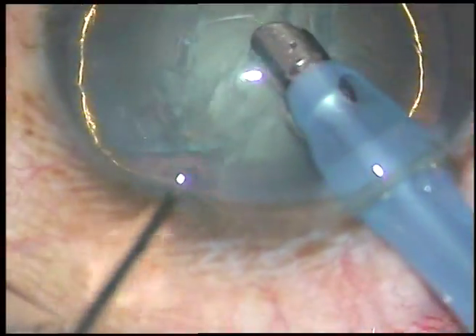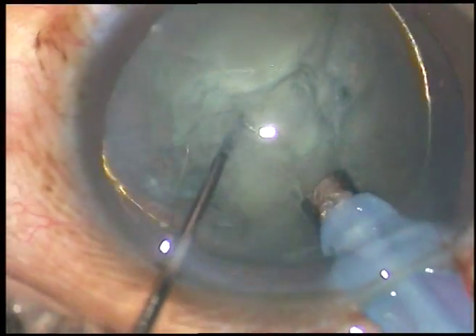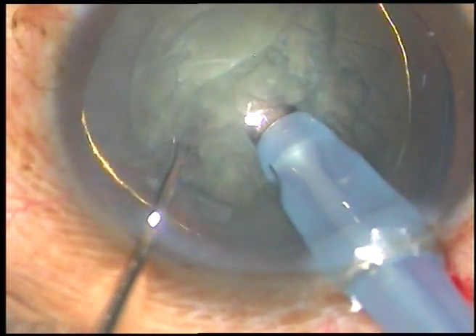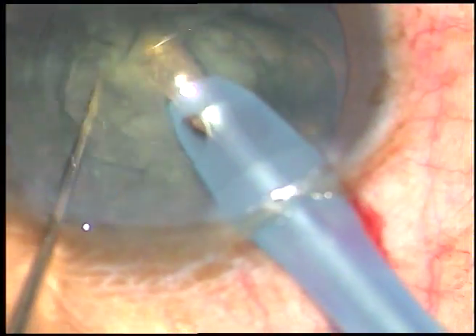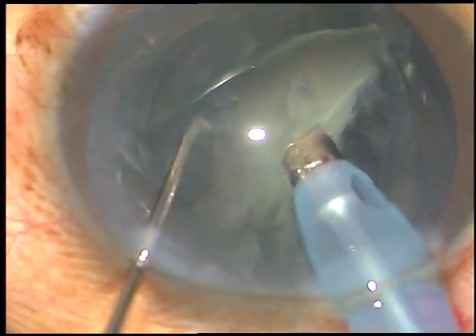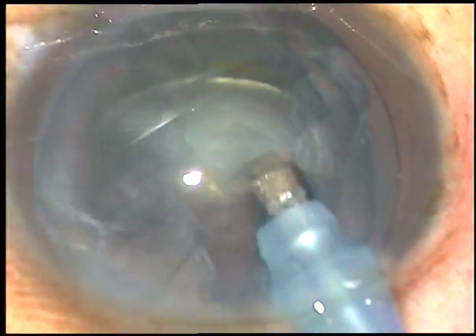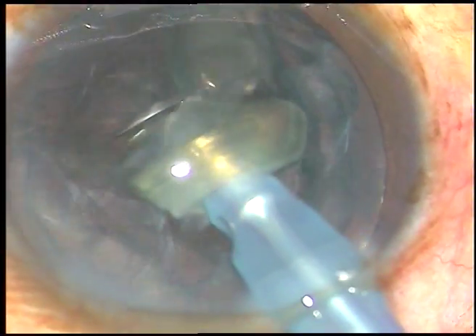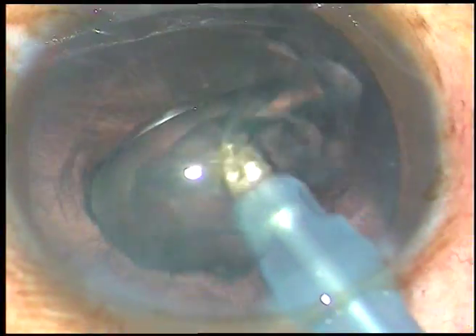Now the tip of the phaco handpiece is introduced into the anterior chamber. The tip is buried into the substance of the nucleus and the nucleus is chopped; one half of the nucleus is emulsified and removed. The other half is also chopped into two parts and each part is emulsified and removed. Since this is a cataract with medium density, it has been very fast in managing the nucleus.